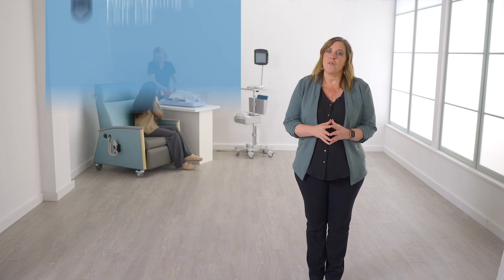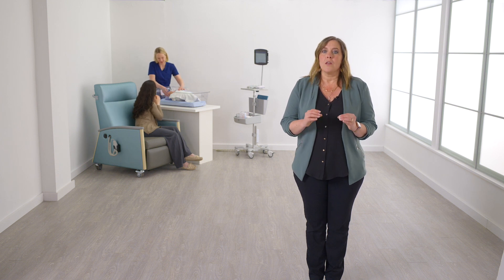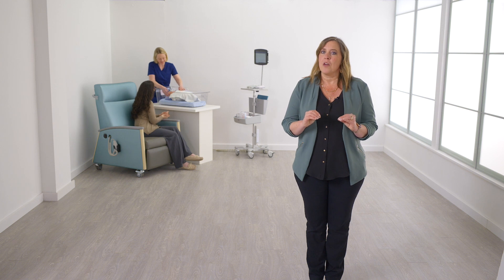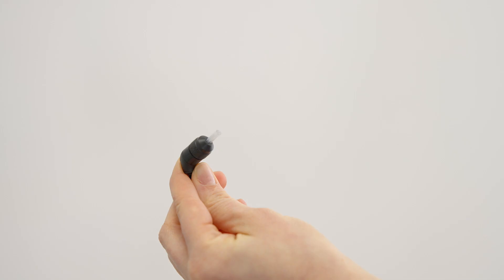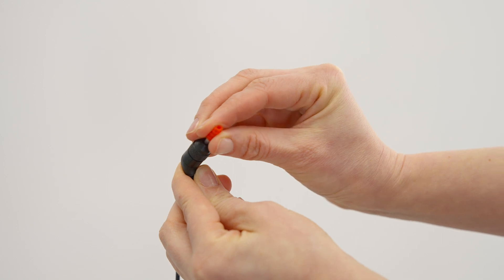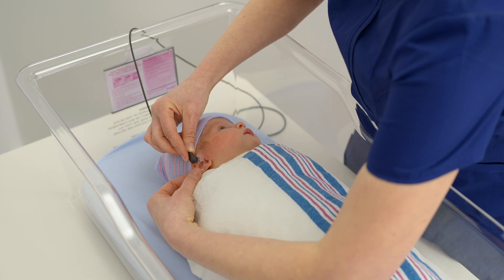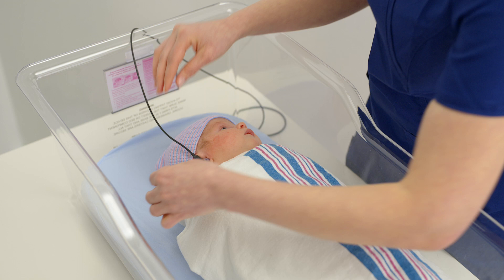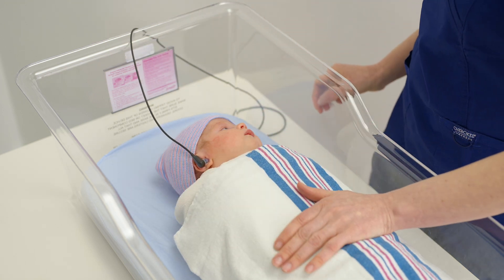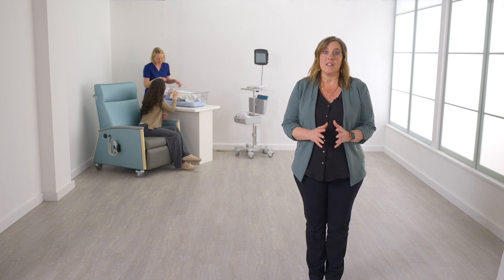It's also possible to perform ABR with the OAE probe. There are two available probe styles, and the procedure for screening is essentially the same for both. When using the OAE probe, you must test one ear at a time. Choose the proper size ear tip based on your inspection of the baby's ear canals and apply the ear tips to the OAE probe. Insert the ear tip into the baby's first test ear by pulling down and out on the ear lobe to open the ear canal, then aim and insert the ear tip gently but securely. Release the ear lobe and ensure that the ear tip is firmly in place.